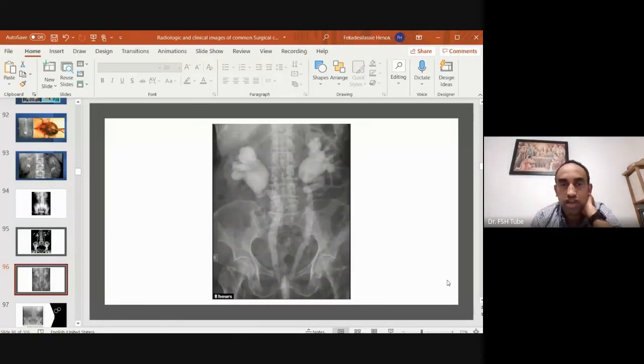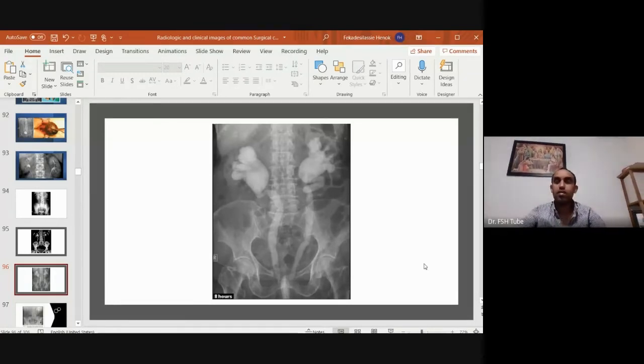So what do you see here, spot diagnosis? Yeah, but be specific, because you are right, it's hydronephrosis. It's not only hydronephrosis and there is a lot to be described. So it's bilateral. Dilated ureter, mega ureter, right? So you have hydroureter and hydronephrosis, bilateral hydroureter and hydronephrosis.